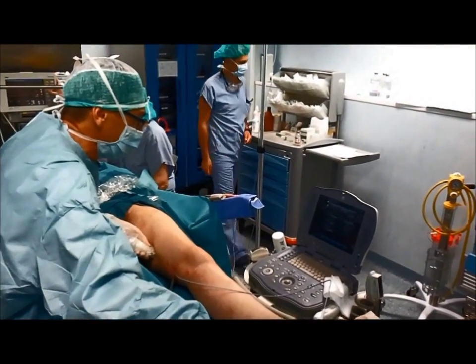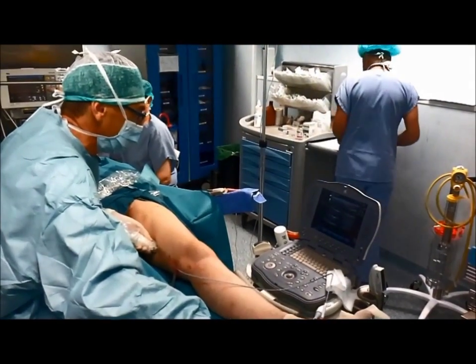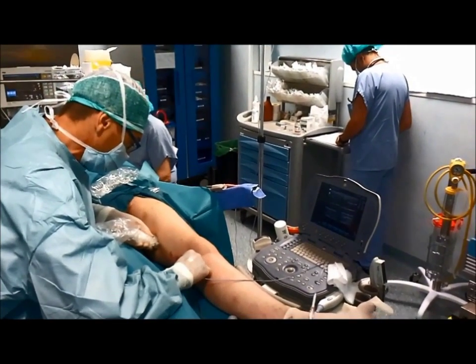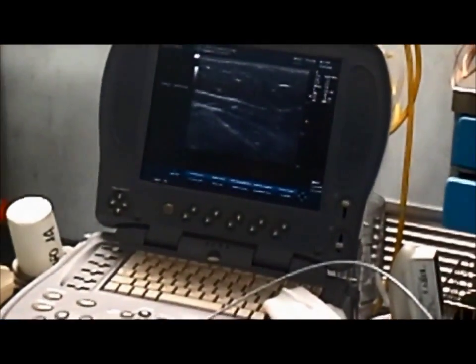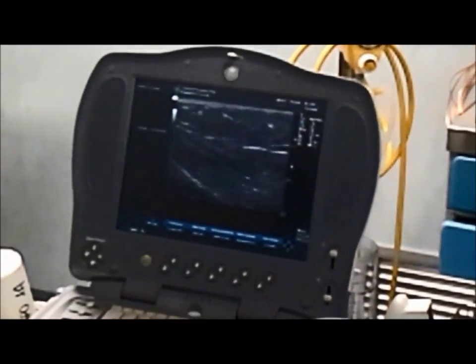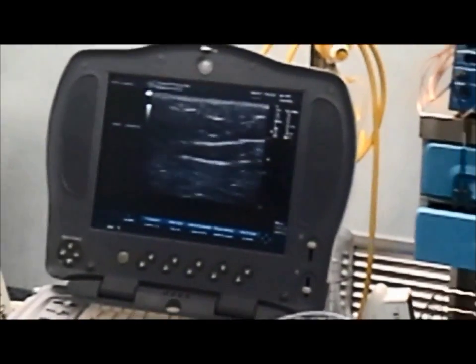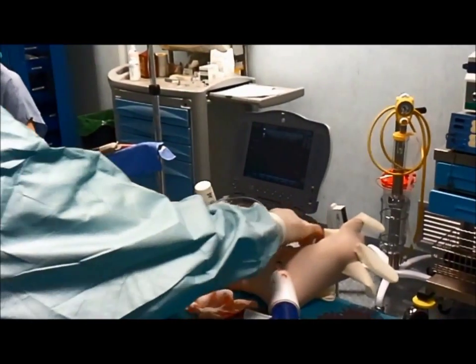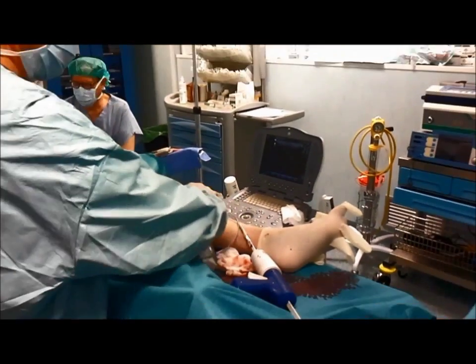Following each injection of glue, the catheter is immediately pulled back 3 cm and external compression on the vein is held with the ultrasound probe and fingertips. No compression stocking is prescribed at the end of the procedure, and the patient can immediately resume normal daily activities.